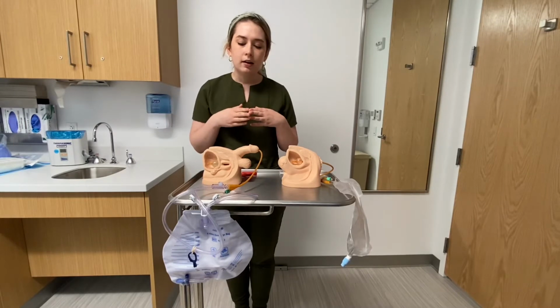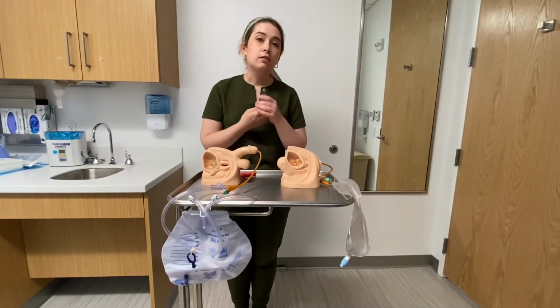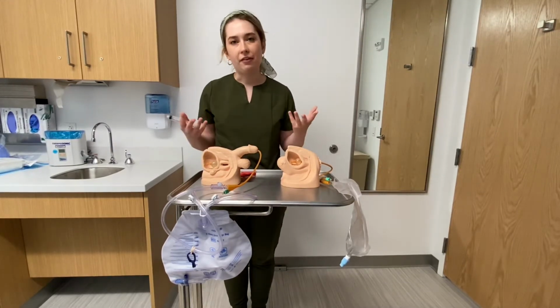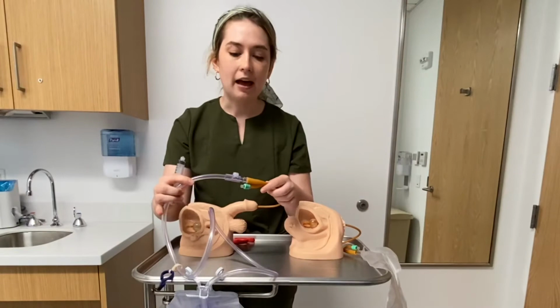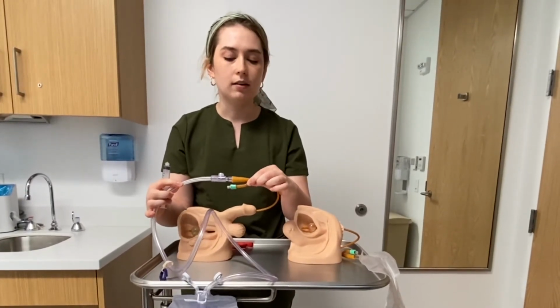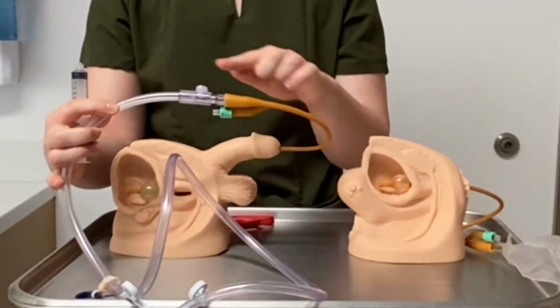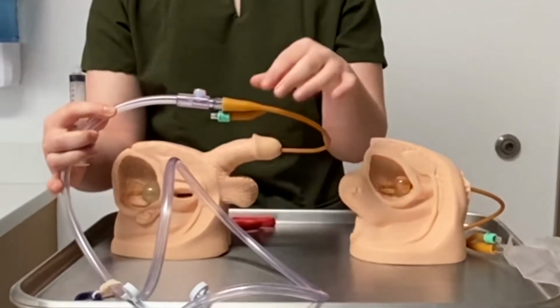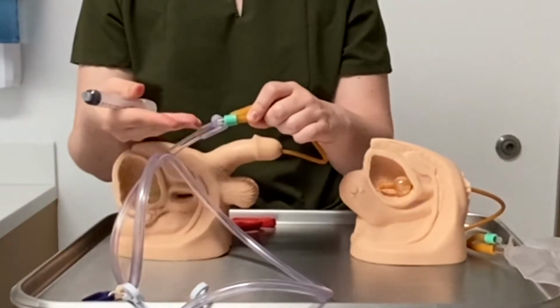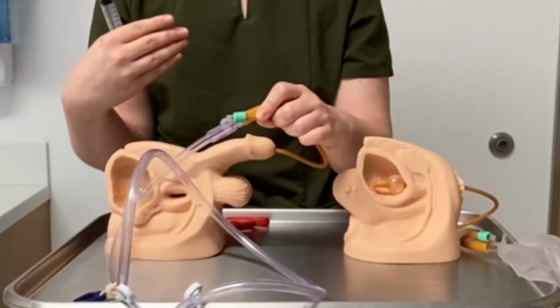The main way that we'll advise you to remove the catheter is by using a syringe to deflate the balloon with the saline and remove the catheter very easily. When you look at your catheter, there's going to be two different knobs coming out of the tube. You're going to see the one that goes into the catheter bag, and there's also going to be a port with usually some color at the end. Your color may be different than the one I have in the video.